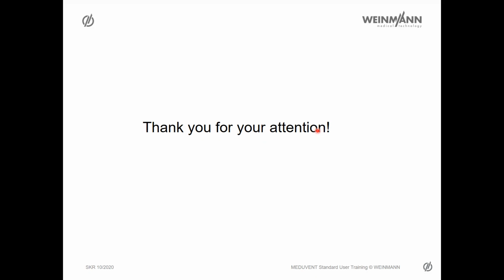Are you going to explain about the service manual? No, that's something for the service training. So that's not my part here.